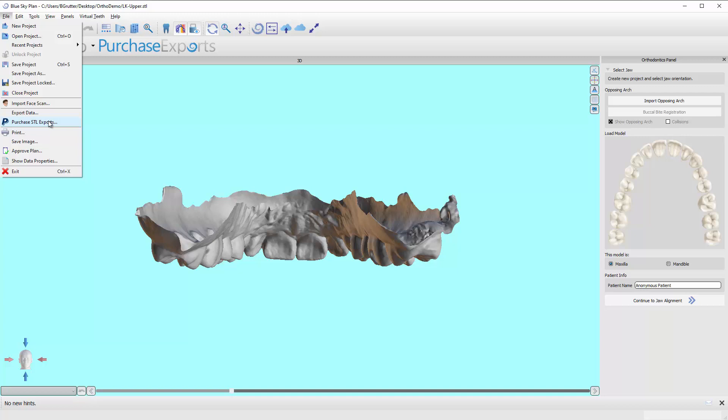It doesn't matter how many models there are, but it costs usually around ten dollars or less for the upper arch and ten dollars or less for the lower arch. Again, that's not per model. That is for the entire patient setup.